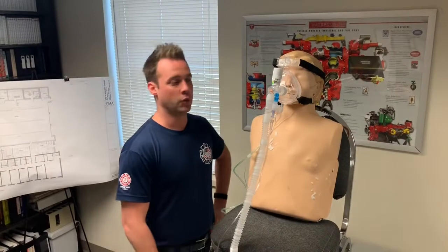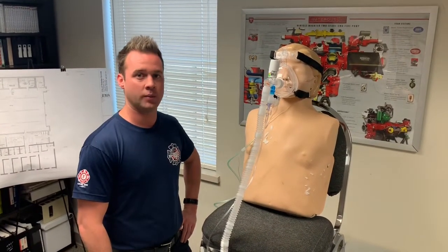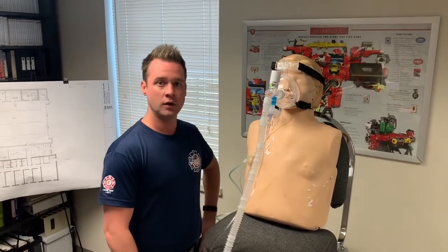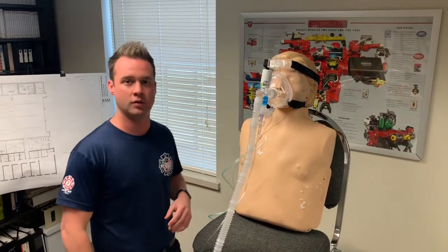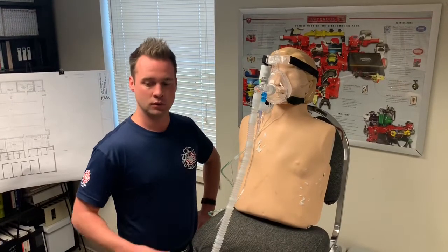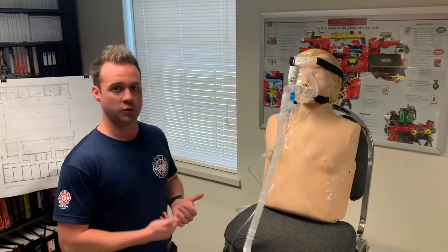And it's also important to remember that the full benefit of CPAP does take approximately 3 to 5 minutes to achieve, to actually reinflate the lungs and get those alveoli open. So if your patient isn't improving after a few minutes, just give it some time before you decide to take the treatments elsewhere. Indications. These are going to be respiratory patients.